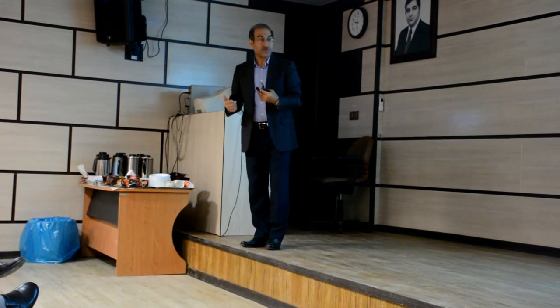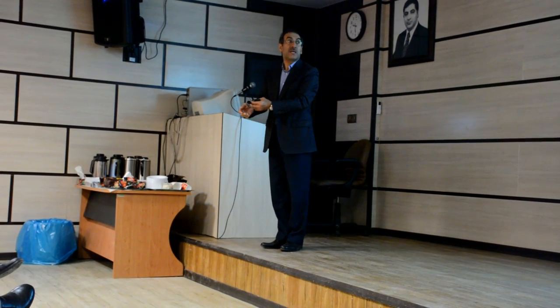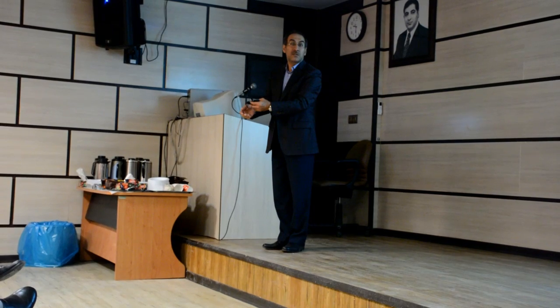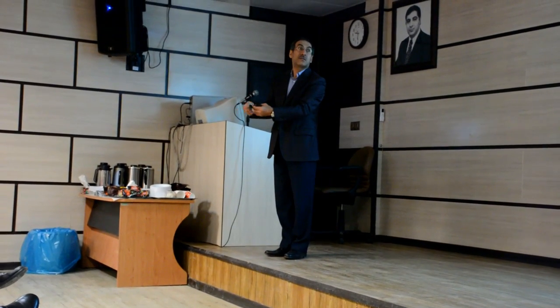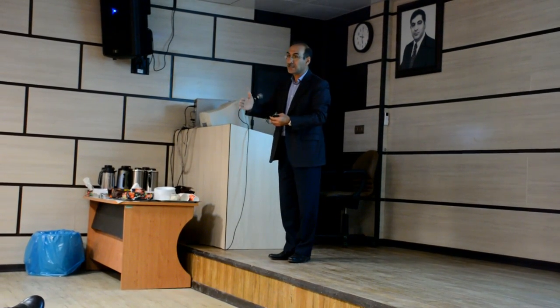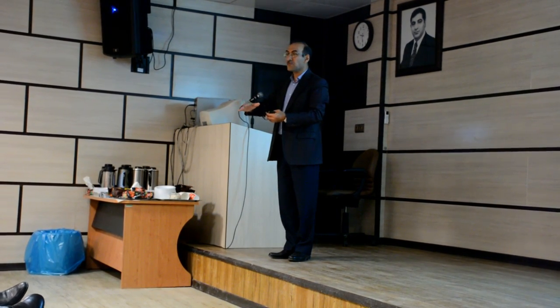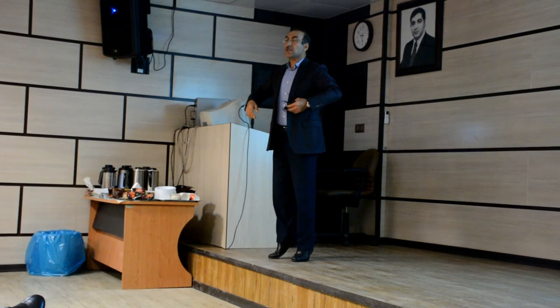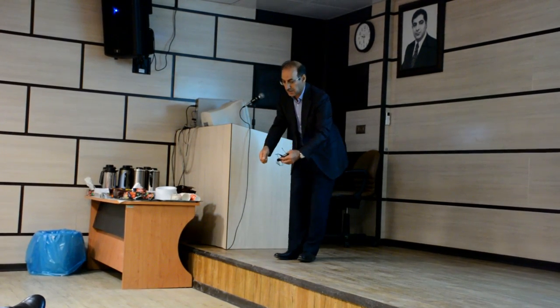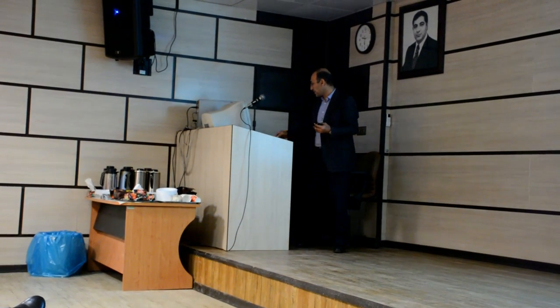And in laparoscopy, in our setting, sometimes the patient is in this direction, but the monitor is in that direction. You work like this, so difficult. Sometimes the professor is tall or short, and the assistant is the opposite. If you adjust the bed for the professor, the assistant works like this or like this. It's so difficult. These are some issues of laparoscopy.